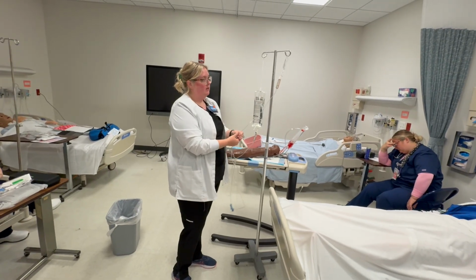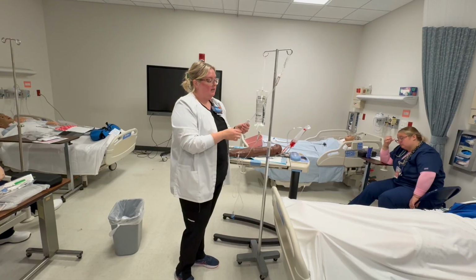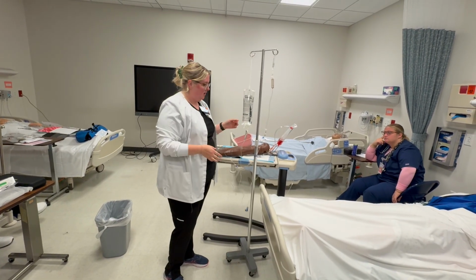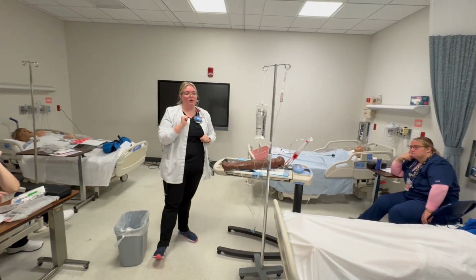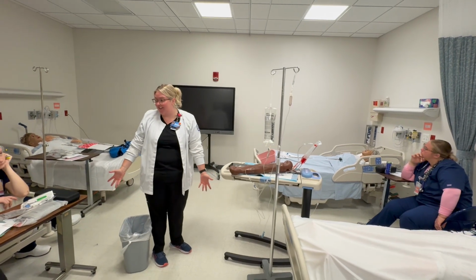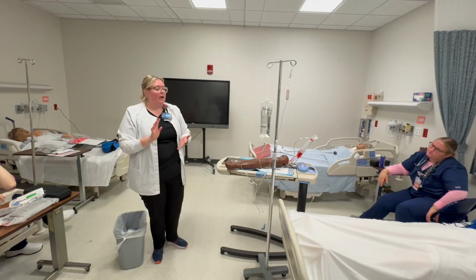When they're unclamped, they move freely. So you'll see a lot of times in practice, I'll be going like this to make sure they're unclamped when I want them to be. You check all your tubing, good, I want to see that. I don't want to see you say it's not working and then look to me for answers, right? You need to use your nursing judgment. We talked about it, and recognize that.